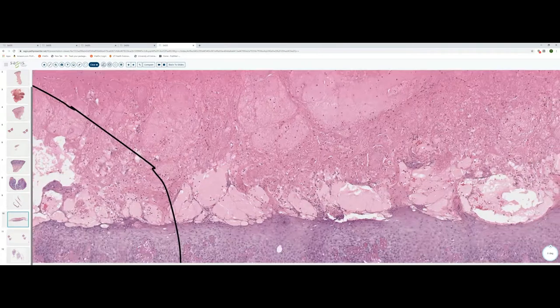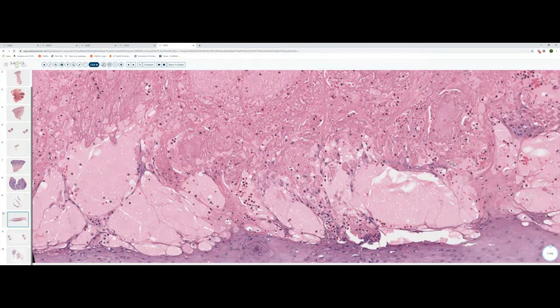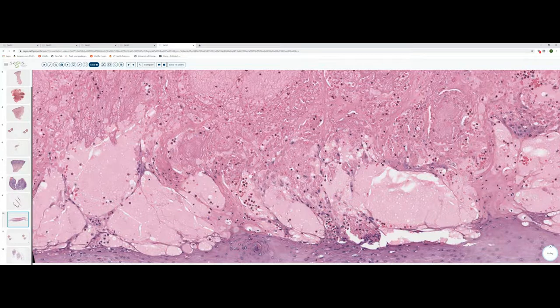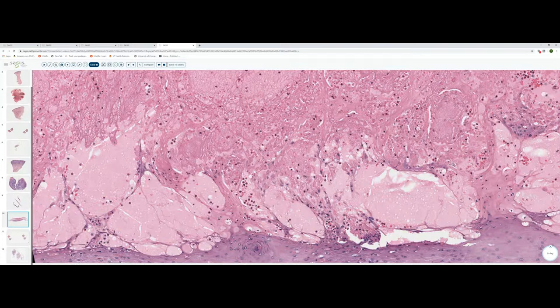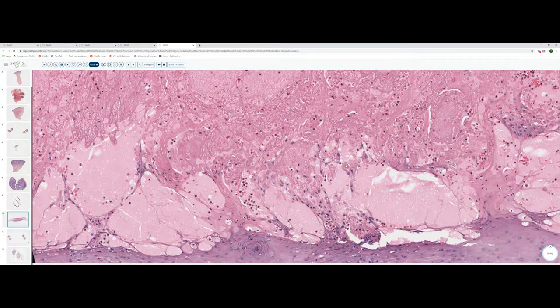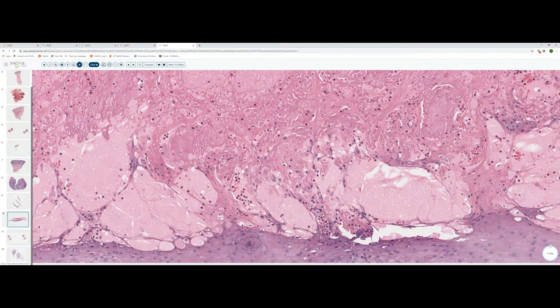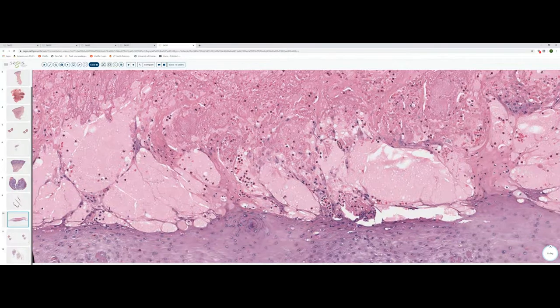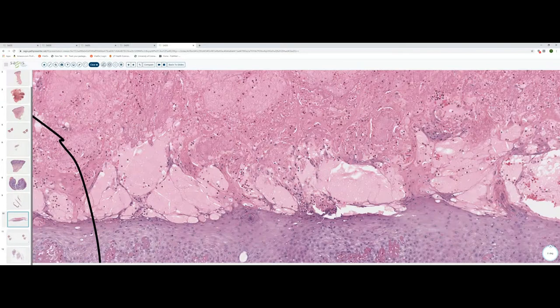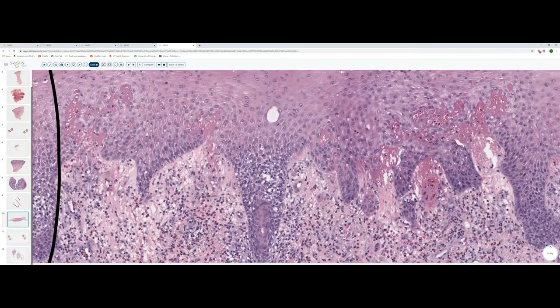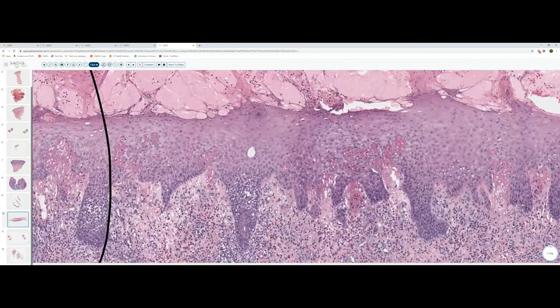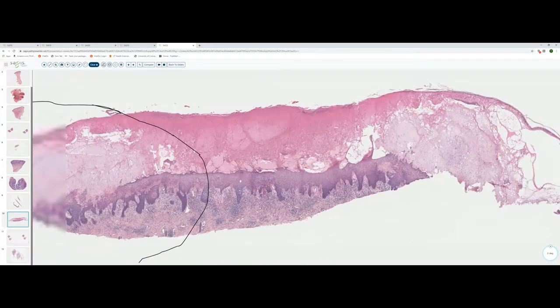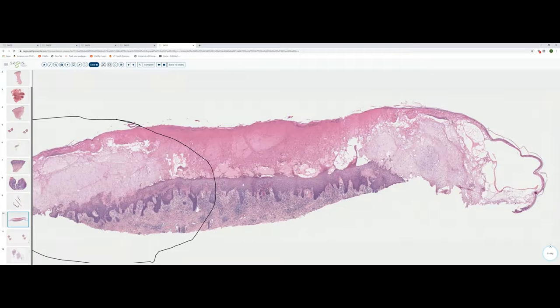And viral processes. Now there's certainly no evidence here of a herpes virus infection. There's no evidence of peripheral margination of the nucleoplasm. There are no multinucleated keratinocytes. There may be within some of these cells, a little bit difficult to appreciate, maybe an occasional small viral inclusion. But within the underlying dermis, there's a mixed cell infiltrate that contains lymphocytes and numerous eosinophils and some papillary dermal edema. And this constellation of features is highly suggestive of this condition. This is a parapox virus infection. This is ORF.